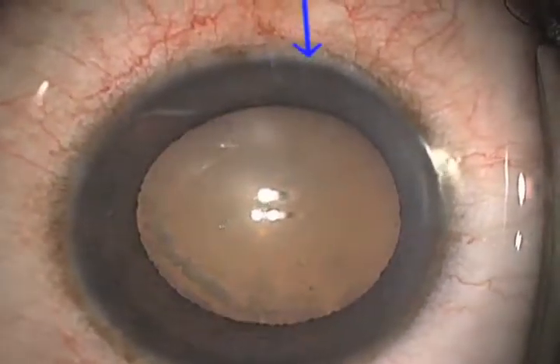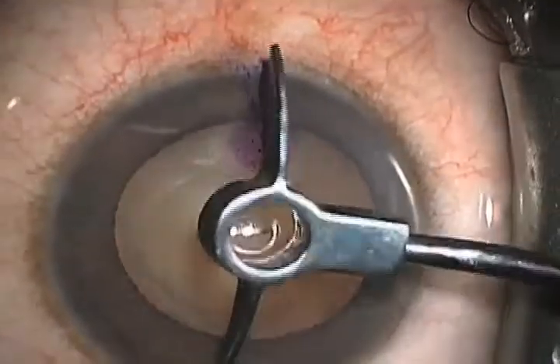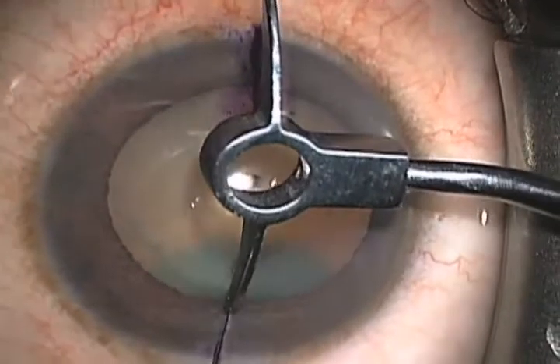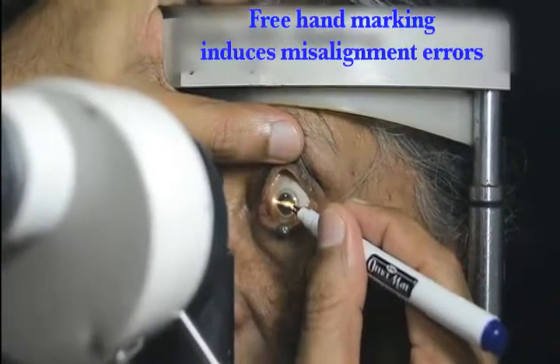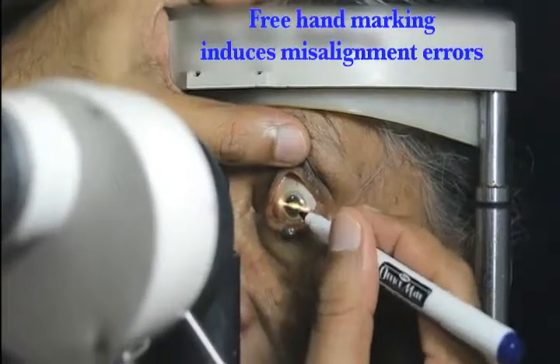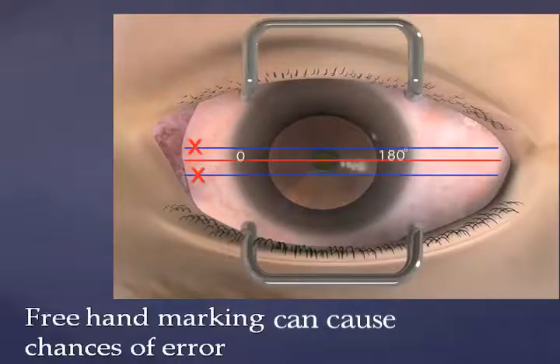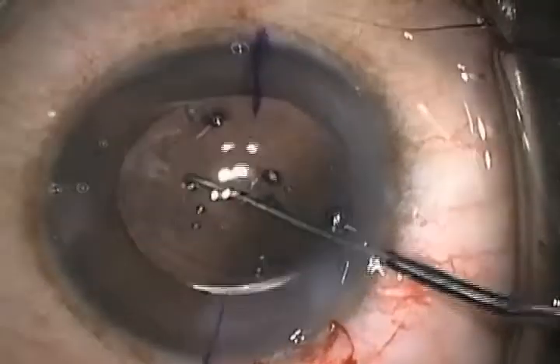Worldwide, adopting this toric IOL in cataract surgical practice requires pre-planning of two markings. Appropriate surgical instrumentations are required to perform these markings. Freehand marking induces misalignment error in the exact identification of the 0 to 180 degrees axis, which may lead to a shift of the toric IOL placement axis concurrently.